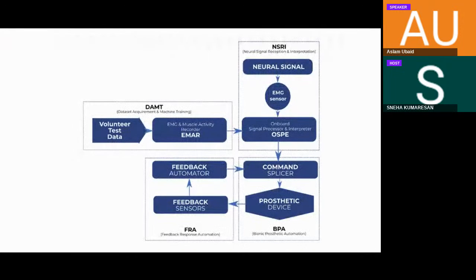And this is not just limited to an arm. This device could be implemented into a prosthetic leg or a prosthetic spine even. That was the big idea, to be able to make people walk from their beds. Like many people who are quadriplegic are confined to their beds and they couldn't even move. That's one of our main focuses.